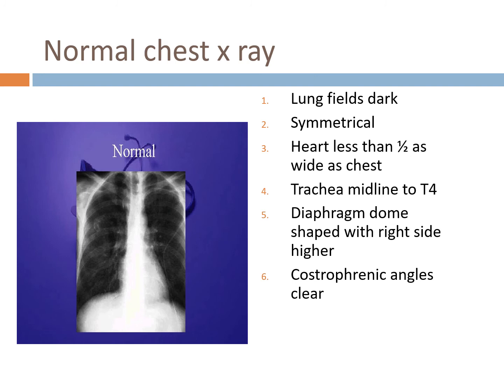Okay, so a normal chest X-ray. Here, this is an MRE question. I'm trying to make sense of my notes here.